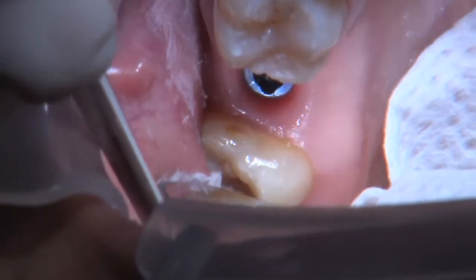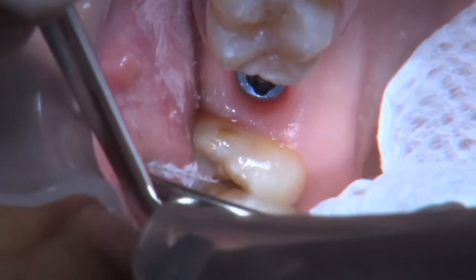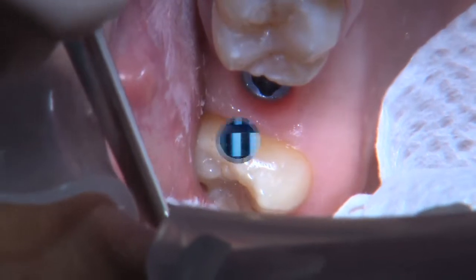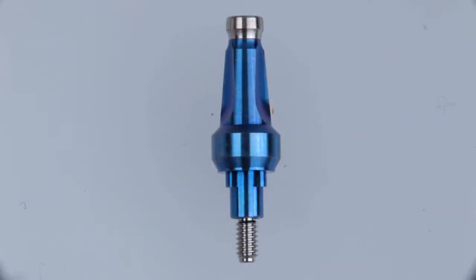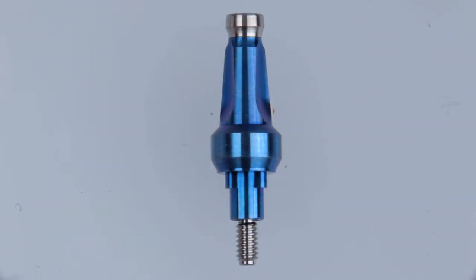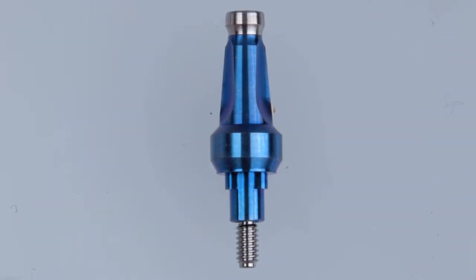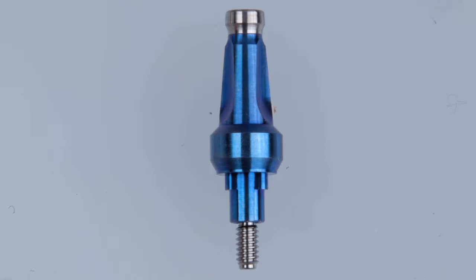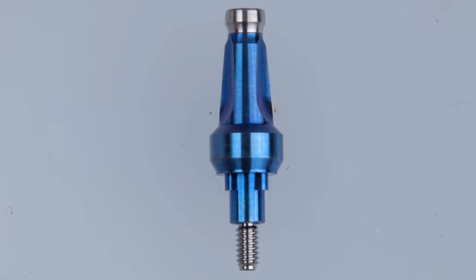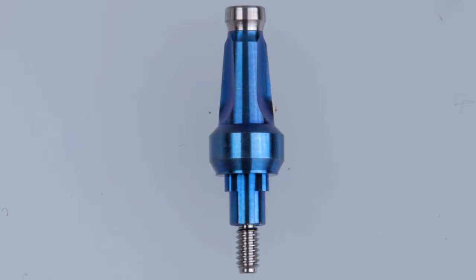A standard implant level impression would involve utilizing a conventional impression post. The problem is that impression posts are round and teeth are not. The iOS FastScan allows you to precisely capture the position of the implant as well as the soft tissue contours.